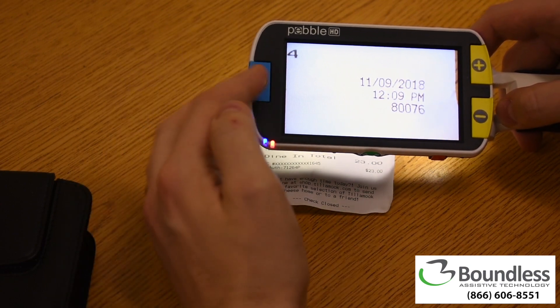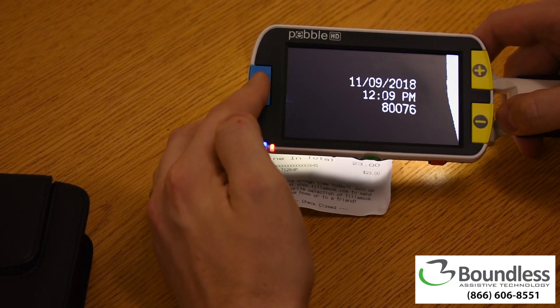On the left side of the screen, one can adjust the image with several different color modes that can increase contrast.